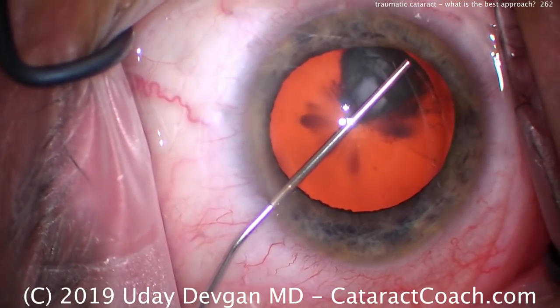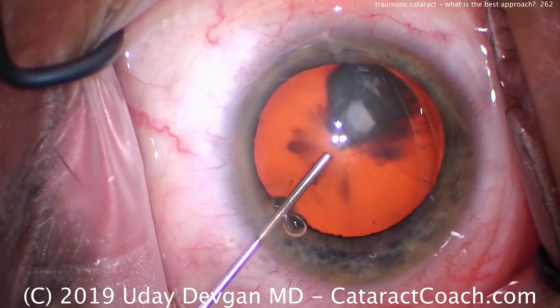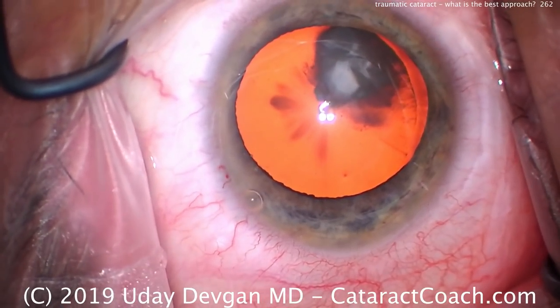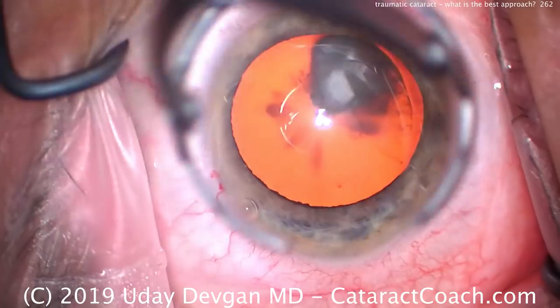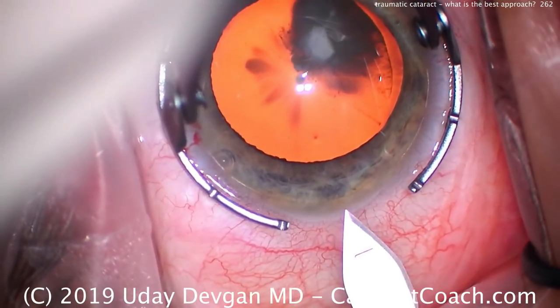And this area right there, is that the lens equator or is that a cortical ring? So far it looks okay. There's no vitreous in the anterior chamber. It looks like the zonular support's pretty good. Let's make the main incision.